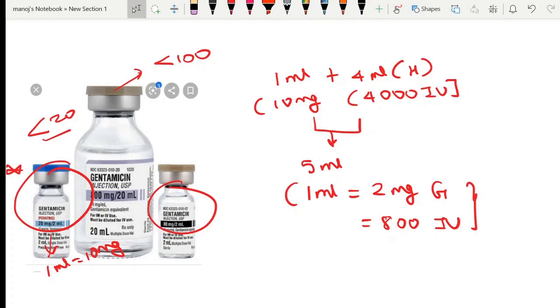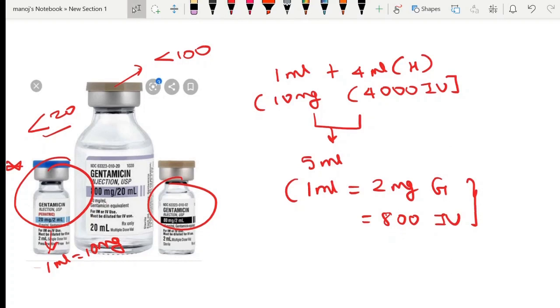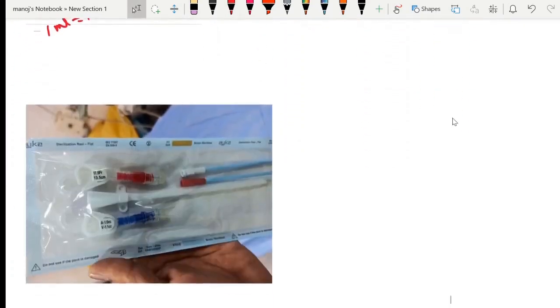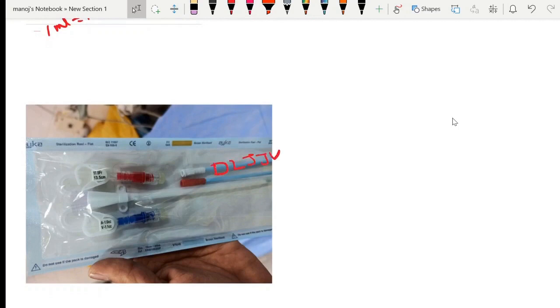How to decide the volume on the catheter side? Here, if you see, this is the simple double lumen IJV that we normally use. This is just shown to display the volume which is written over here. In this normal temporary catheter, which is the non-tunneled one, arterial volume is around 1 cc and the venous priming volume is around 1.1 cc, because venous is always 0.1 higher than the arterial.